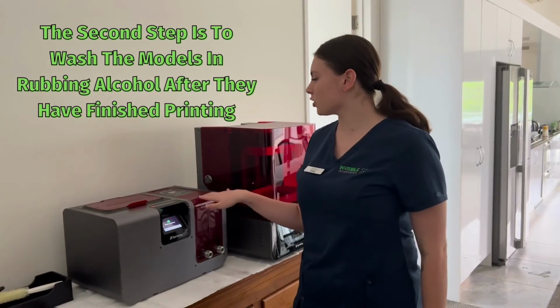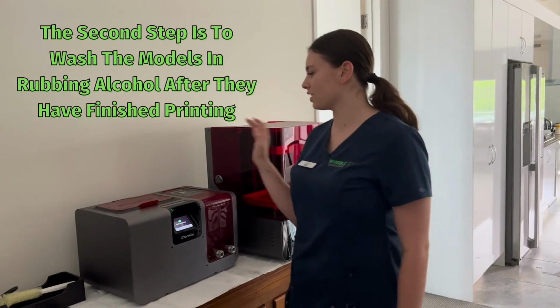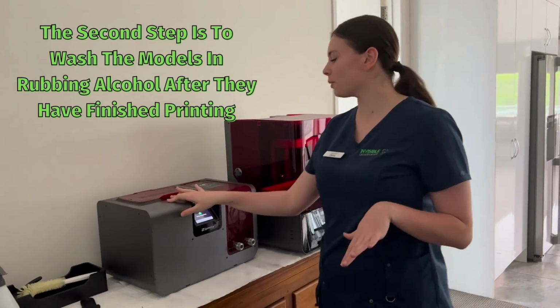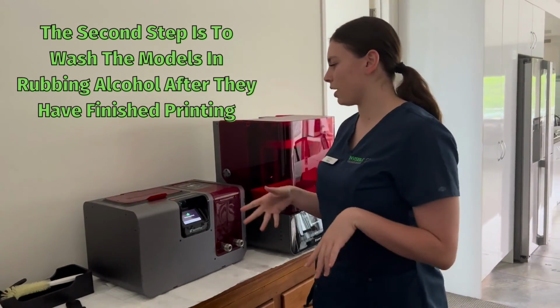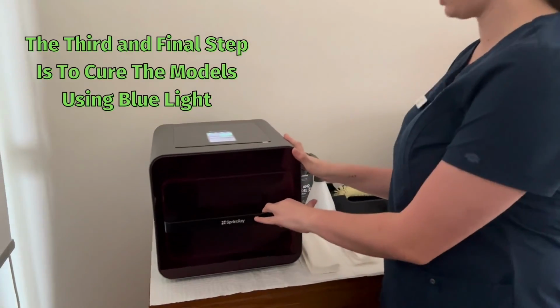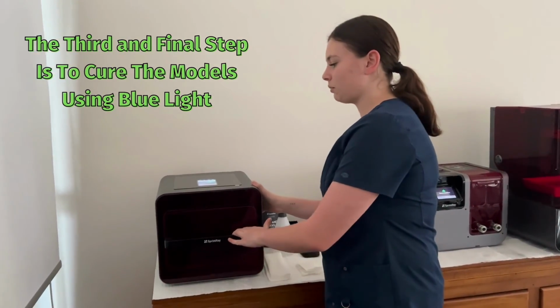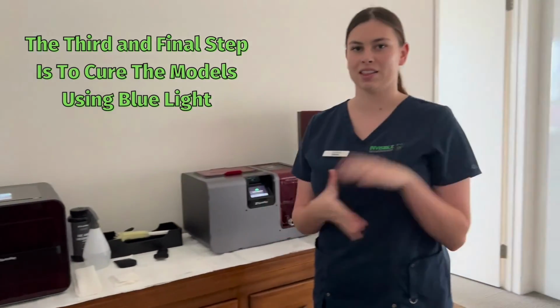So this is the washer we use to wash the models. Once they're done being printed, we use rubbing alcohol to wash them in it. This happens for about 10 minutes, and then we let them dry for a bit, and then we use this machine to set it with a blue light. Once they're done, we take them out and pop them in the bags, and then they're ready to be made.